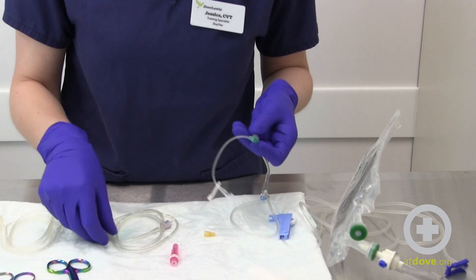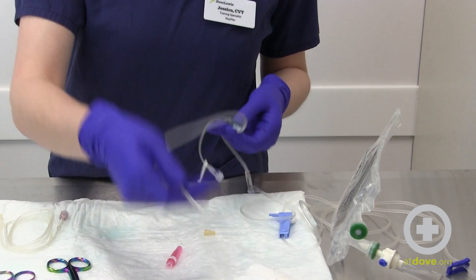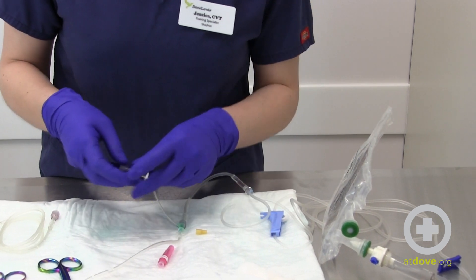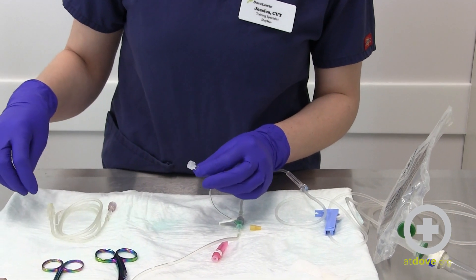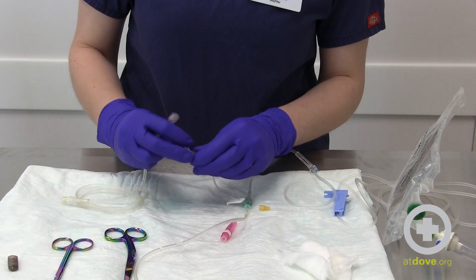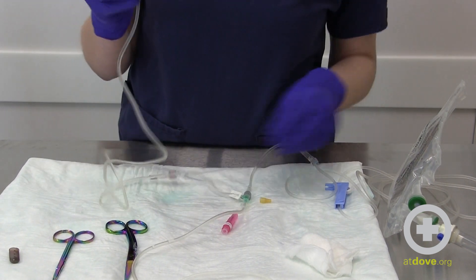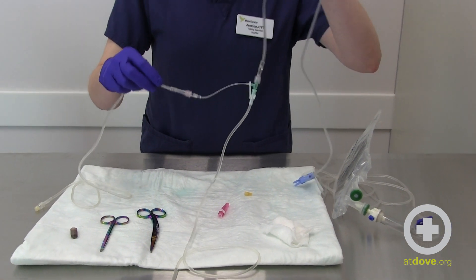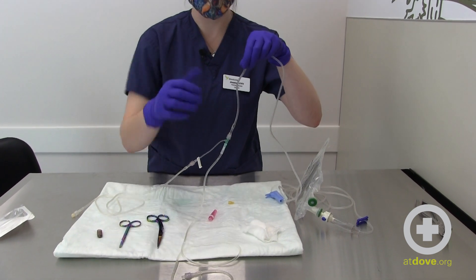Here is my extension set that will be going to my patient. For our second set of fluids or our CRI, we're going to use our other extension set or drip set depending on your protocol and how you usually set it up. Insert that into the side port — pretend that this would go to another fluid setup. So we have fluids running towards the patient, and fluids and/or CRI that are also joining in and going towards the patient.